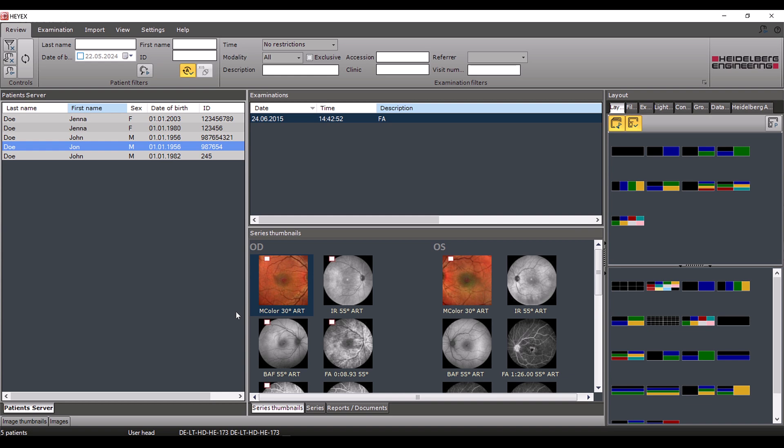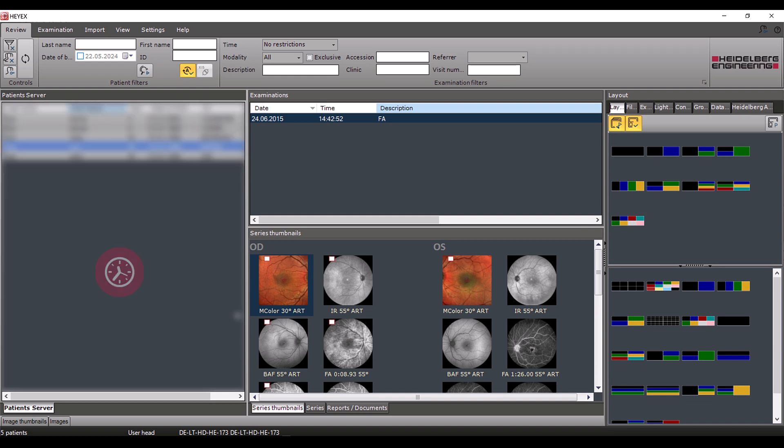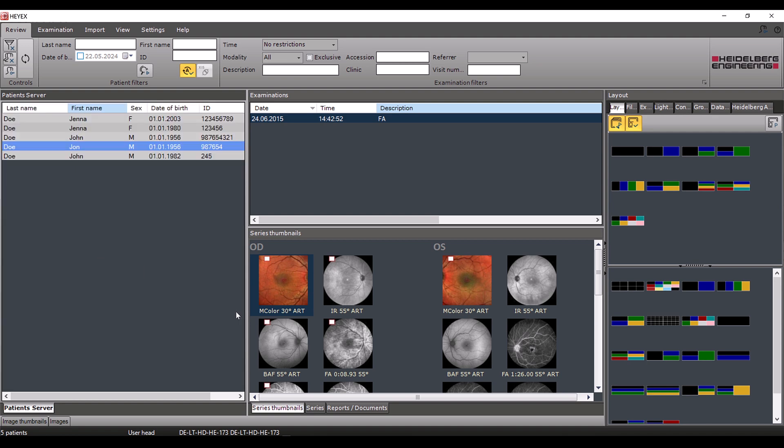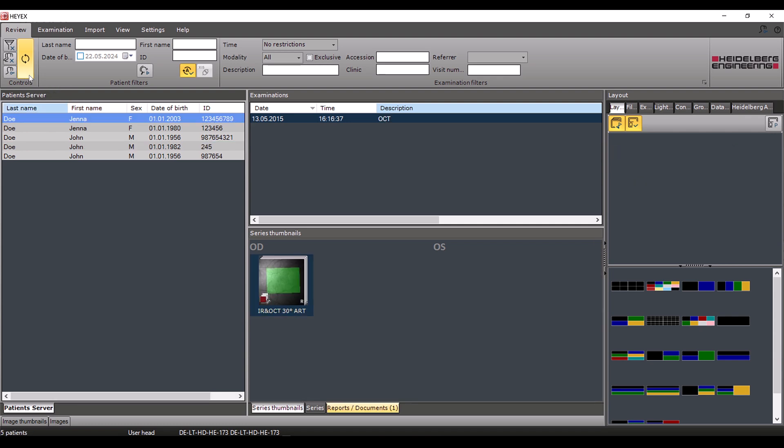Depending on the number of examinations and the size of the data set, it may take several minutes for the changes to take effect. Please always wait until the changes are displayed correctly before starting another procedure for this patient and do not make changes immediately before a planned examination. You can use the refresh button to reload the navigator view and check whether the changes have already taken effect.